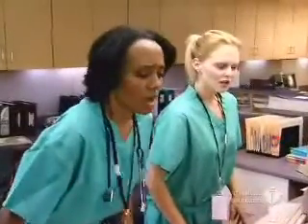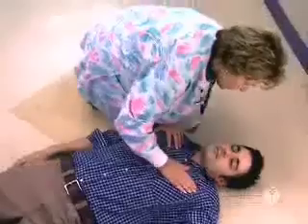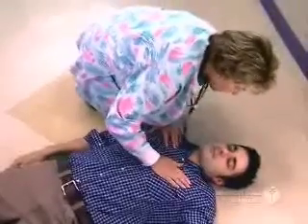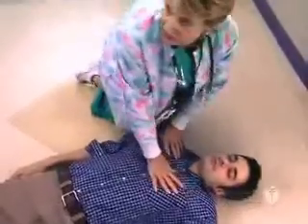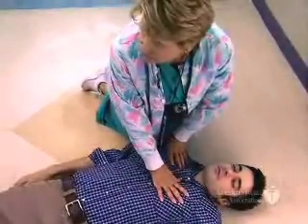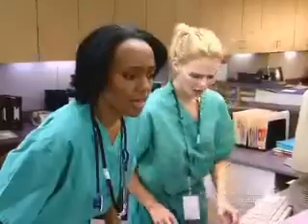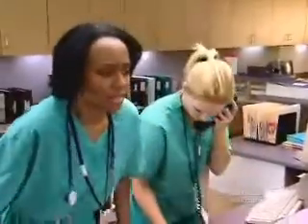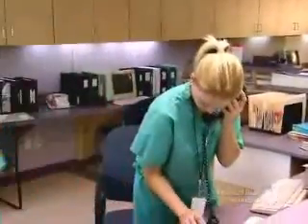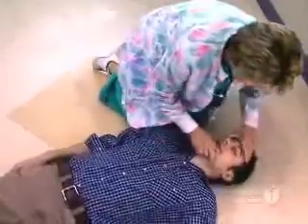If the victim does not respond, one rescuer should activate the emergency response system and get the AED. Pam, call 911. Barbara, get the AED. While another rescuer goes to activate the emergency response system and get the AED, continue the steps of CPR.